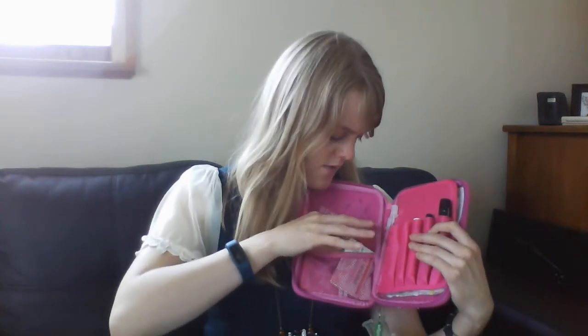Next is my glucose meter. I just keep that down in here in that pocket, so I can do this. Just a plain old glucose meter. Then I have my test strips in the same pocket. Then I have ketone strips. I should have more of those in there, I need to put more in. And then I have this handy little ketone card.